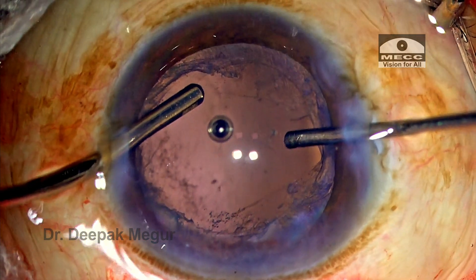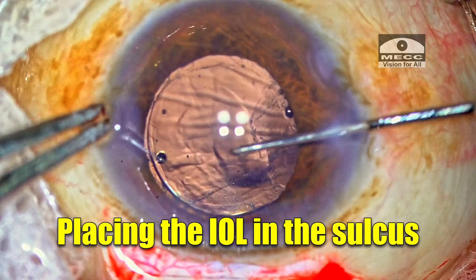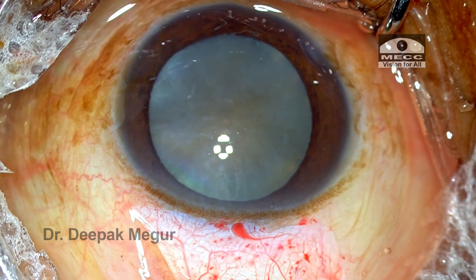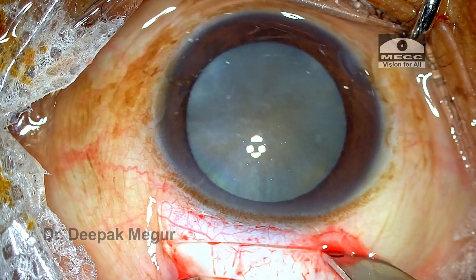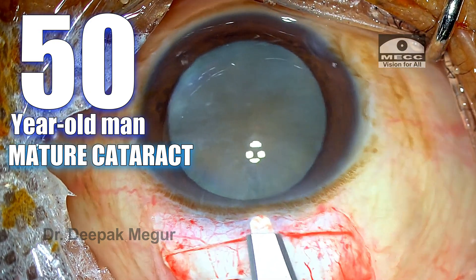We have a young surgeon — she's a senior resident — and she's going to perform an anterior vitrectomy and place the lens in the sulcus. Welcome, I'm Dr. Deepak Megur. This is a case being done by our senior resident, and this is a mature cataract in a middle-aged man.